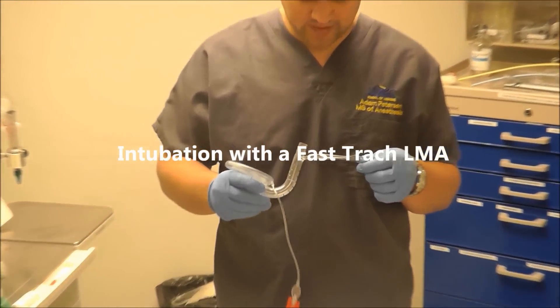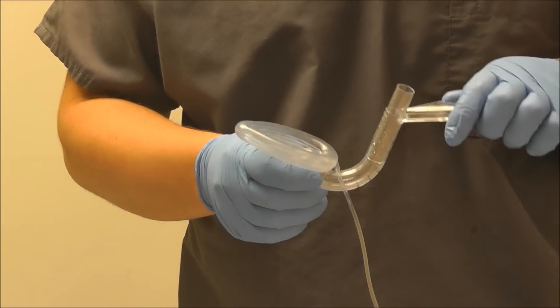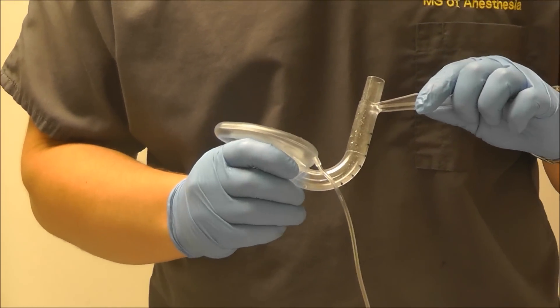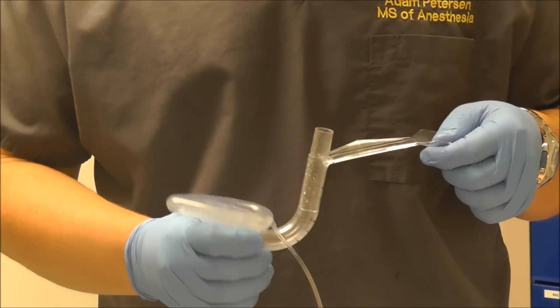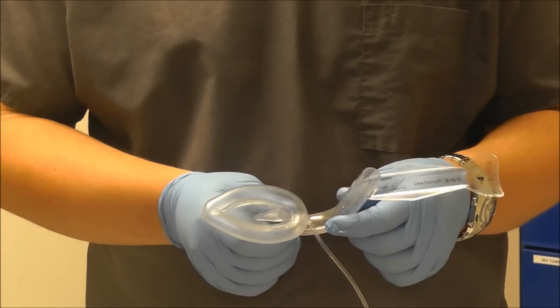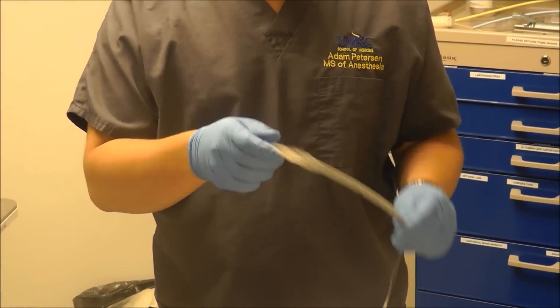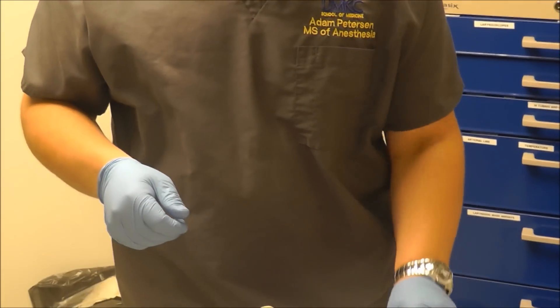Another method of intubating through an LMA is by using a specialized LMA called the LMA Fast Track. What makes this LMA specialized is that it takes a really sharp turn at the bottom which helps direct the endotracheal tube to the glottic opening. It also has a handle on the main portion which allows you to manipulate the LMA and turn it in any direction. The kit also comes with a specialized reinforced, very flexible endotracheal tube and a stabilizer bar which helps aid in removing the LMA.